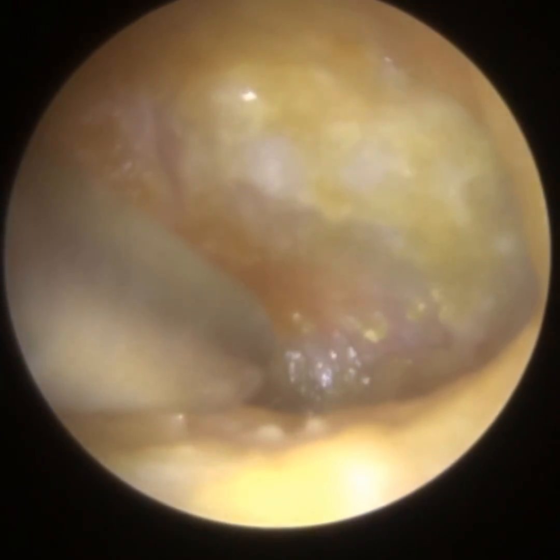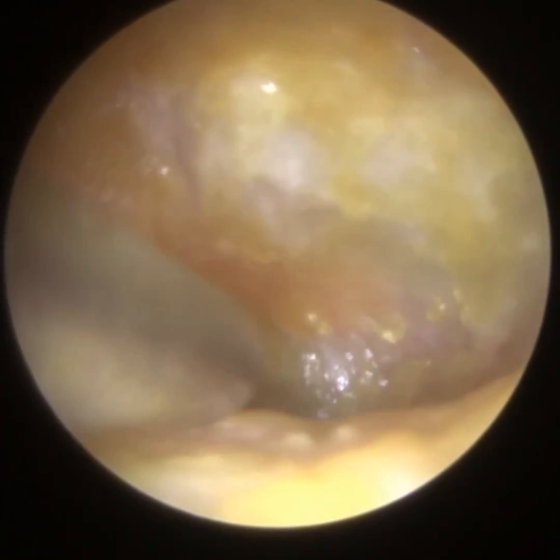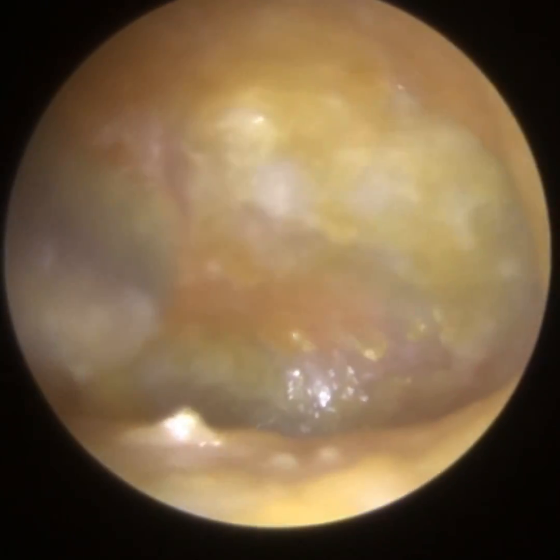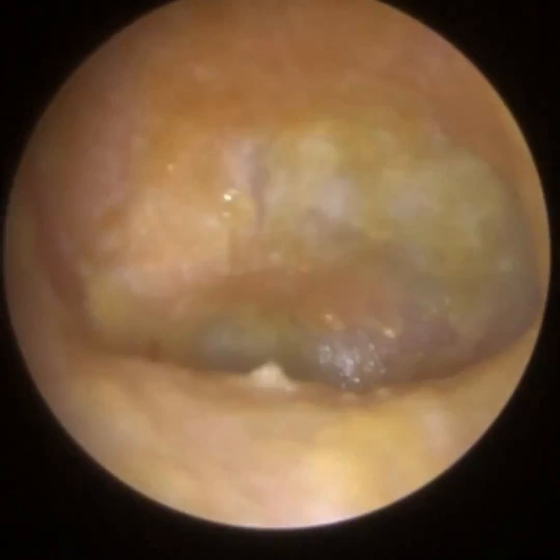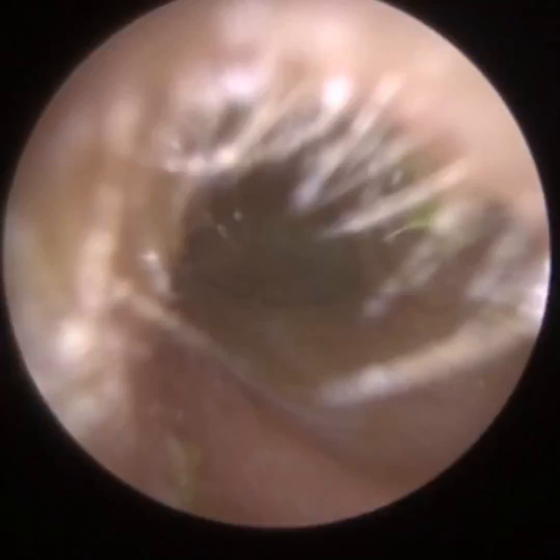But generally, we want to avoid water in the ear, and I have to stress this to the patient. They're a bit surprised when I mention not to use water in the ear. Water is bad for the ears. I always compare it to kryptonite and Superman. You really want to stay away from it when it comes to the ear. So you always have to protect your ear.